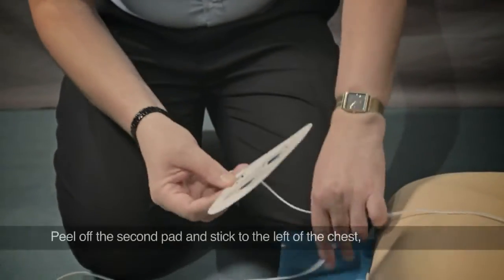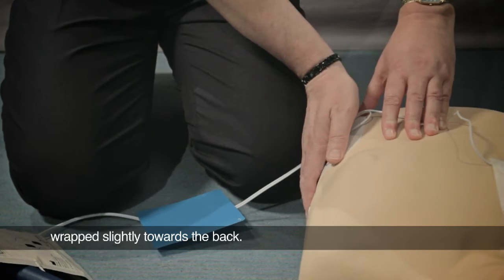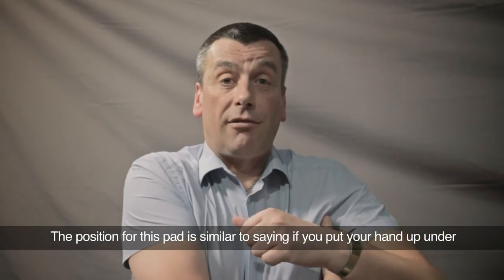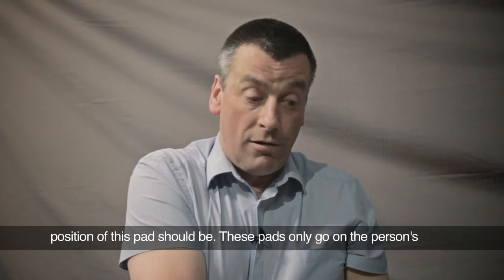The second pad peels off and goes on the left side of the person's chest, wrapped slightly towards the back. The position for that is similar to putting your hand up under your armpit and then bringing your hand a hand's width down — that's roughly where that pad goes.